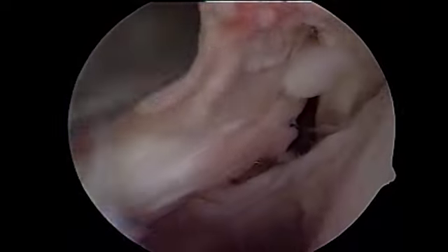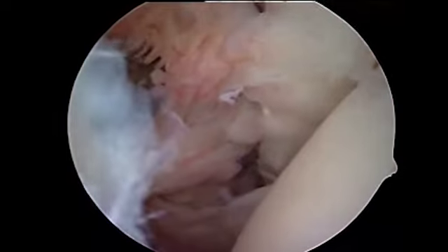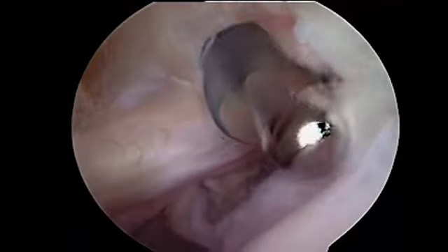In this third example, a significant upper border subscapularis pathology is shown, and in fact, we can see the biceps tendon through the defect in the subscapularis. When we pull on this biceps, again, we can see significant changes in the biceps and a more vertical orientation.